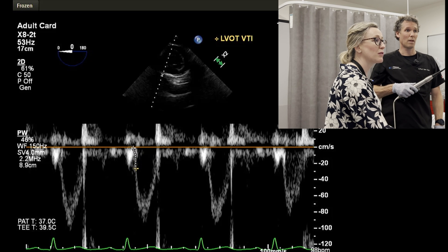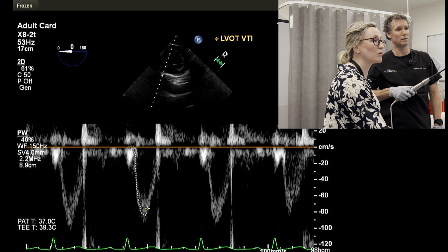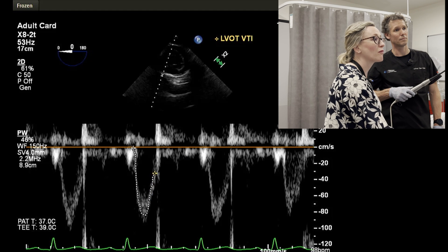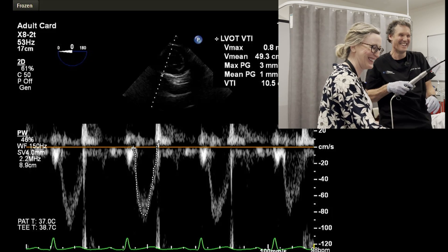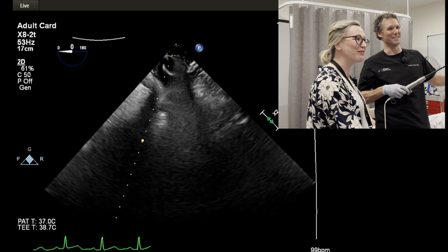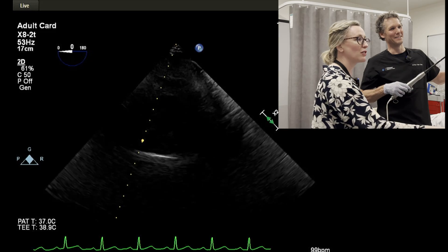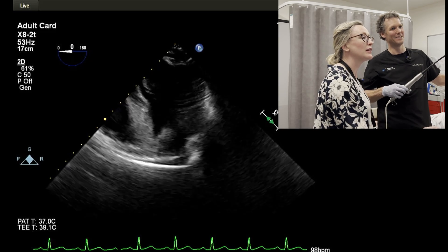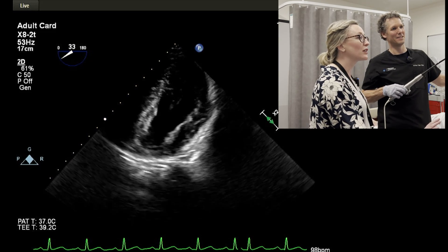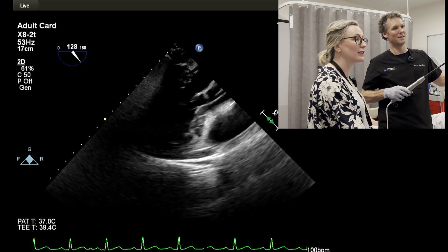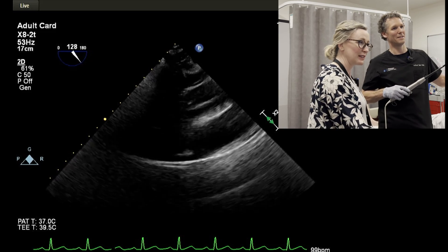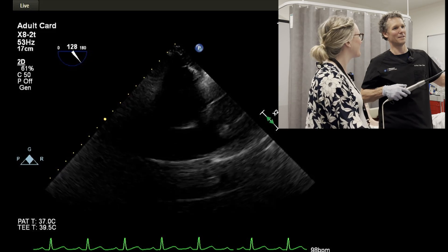Using sinus rhythm so we could just average three, but I'll just show how we would trace the modal velocity. We can come up to just your transgastric view and increase our angle to about 120 degrees, depending on the patient. I think we're just kind of entering a mid-esophageal view there.